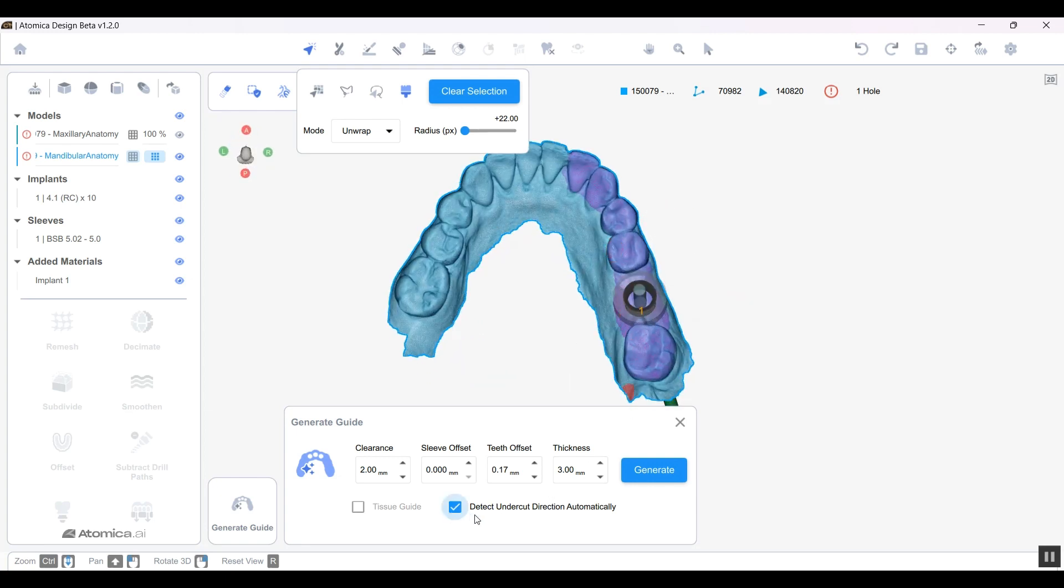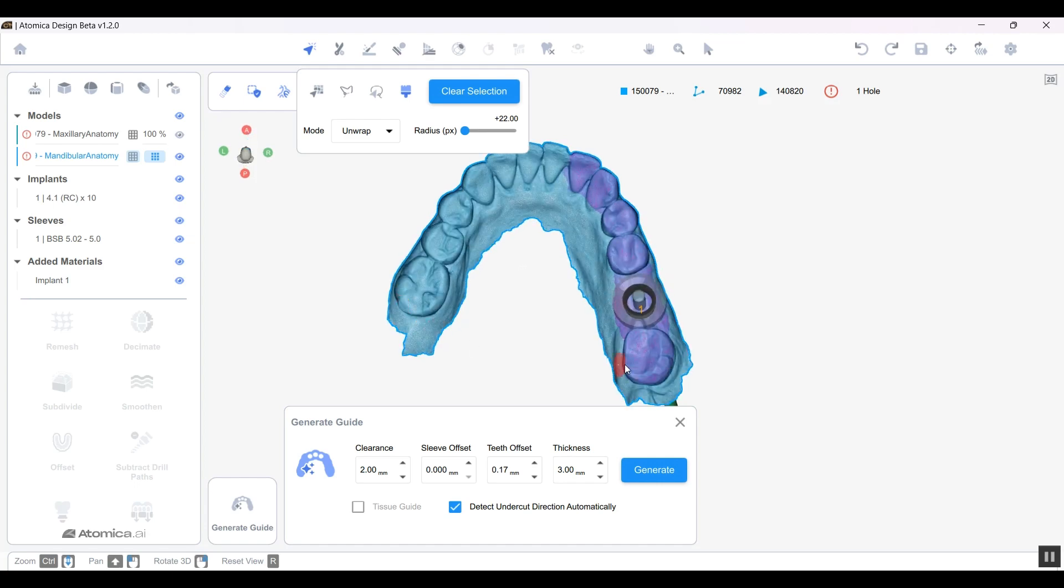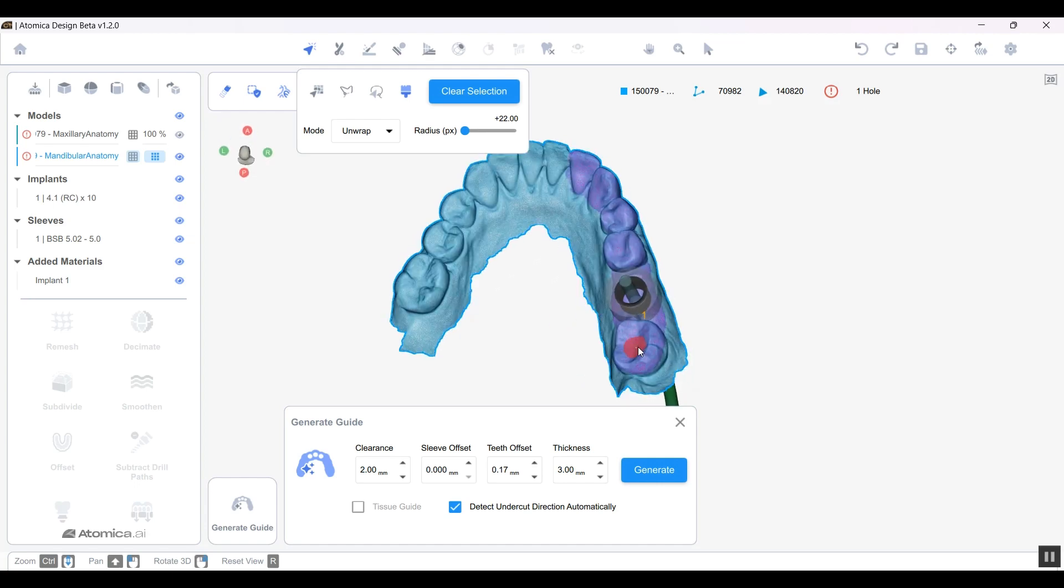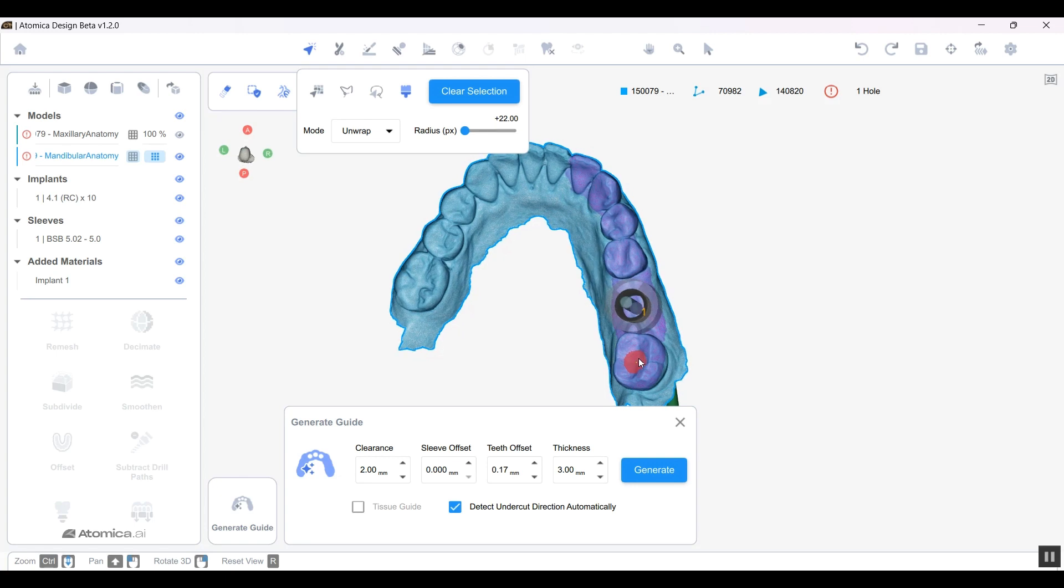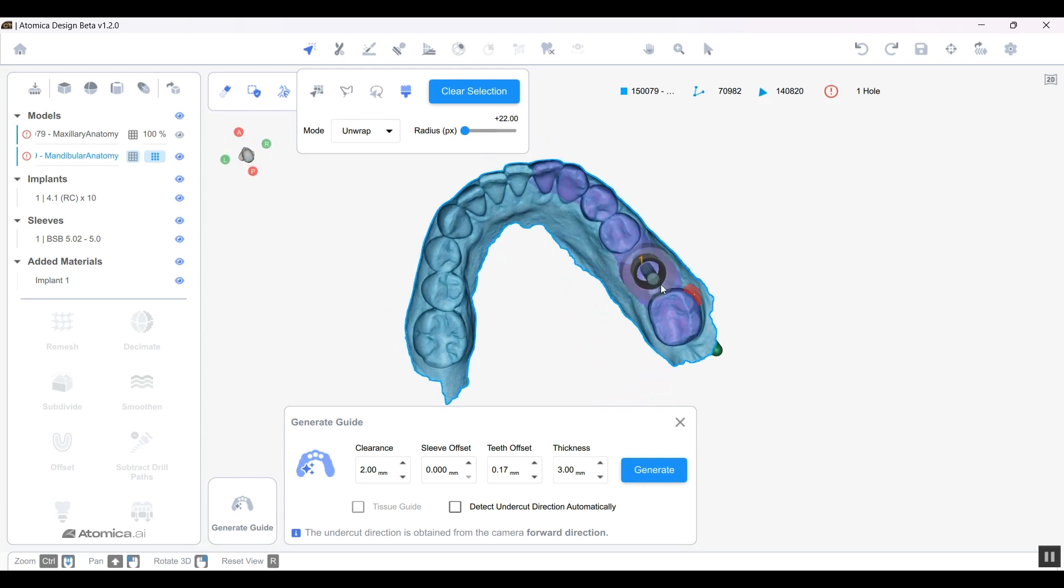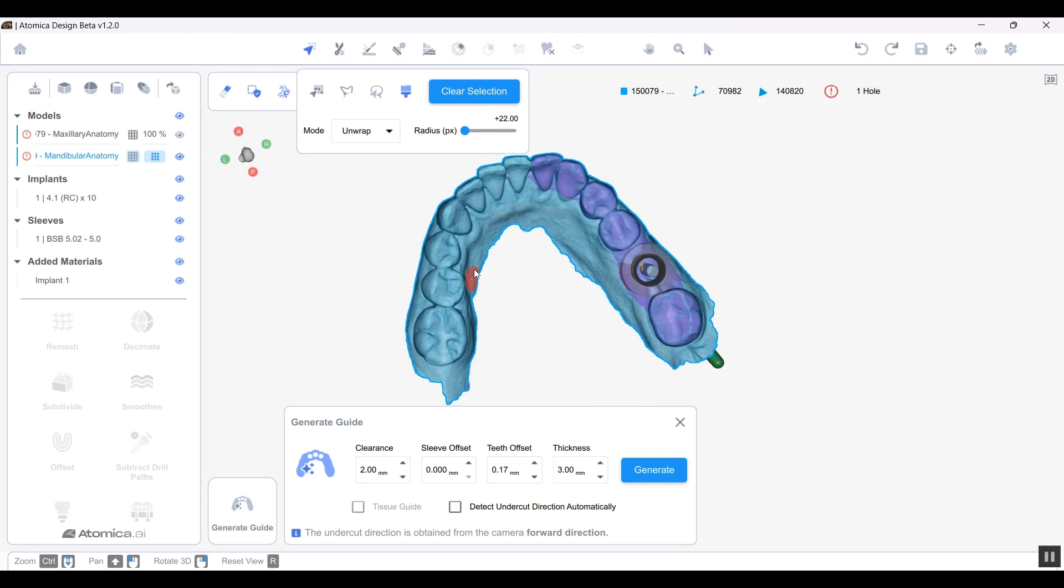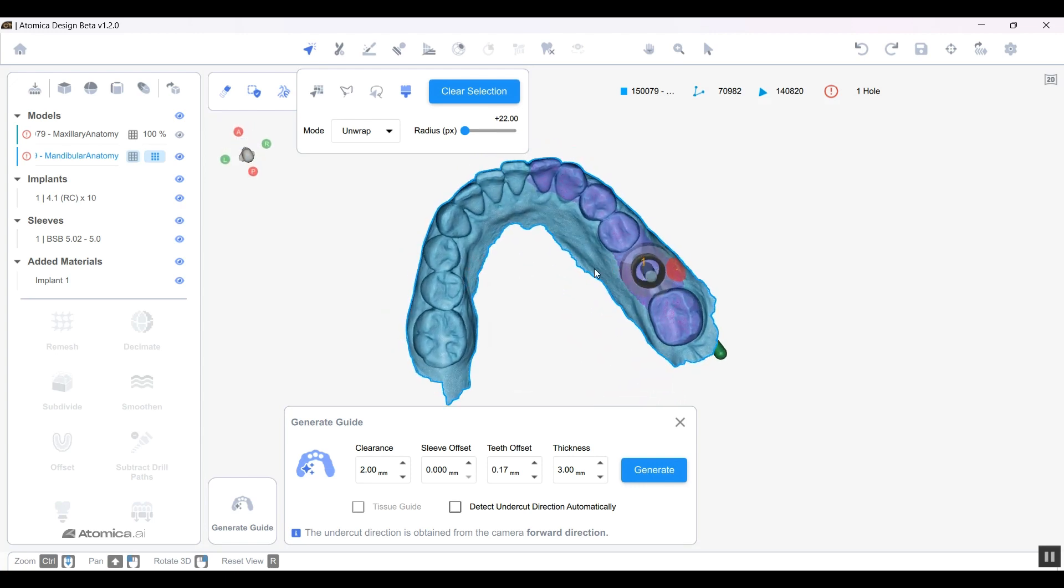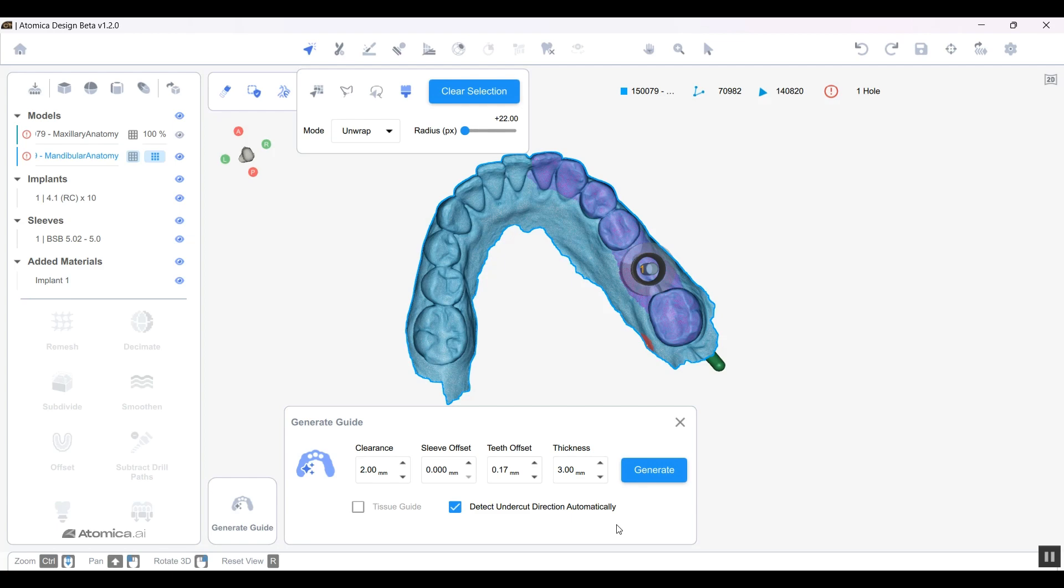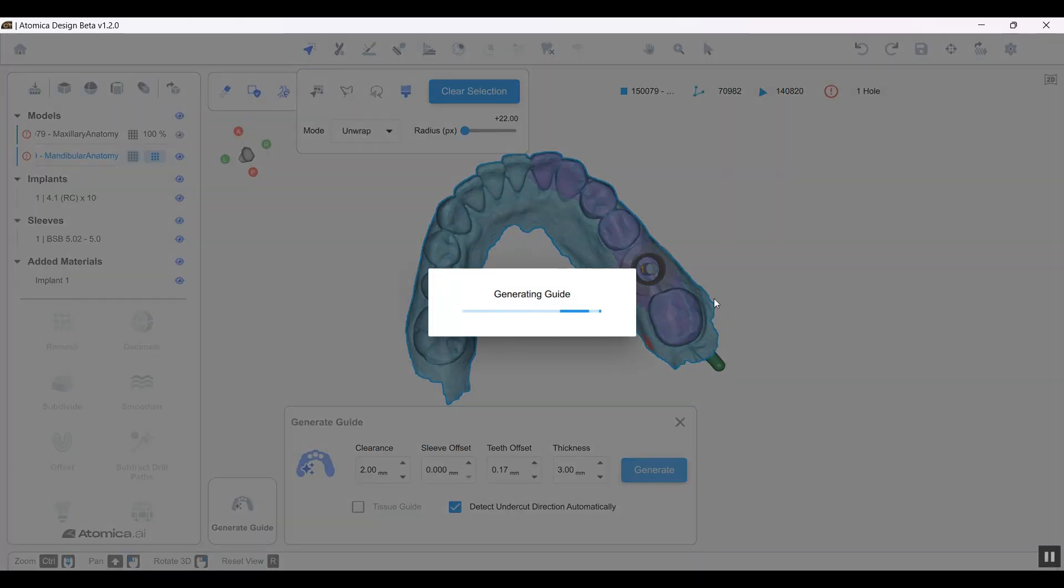Here, Detect Undercut Direction Automatically means the software will detect the undercut and will block it out immediately without positioning the model in my perspective or in which direction I prefer. If I want to do that myself manually, I can uncheck that and start positioning the model in the perspective that I want the undercut to be blocked out. But I prefer to use it automatically right now. Let's go ahead and generate a model and a guide.